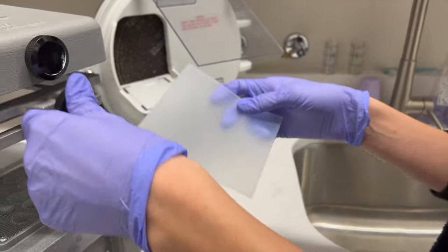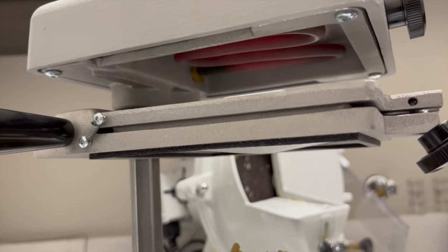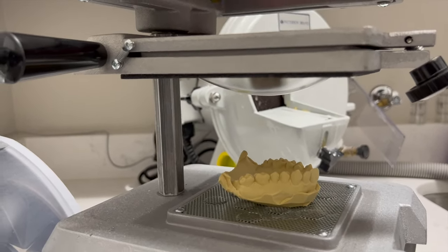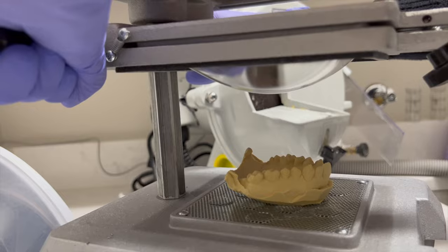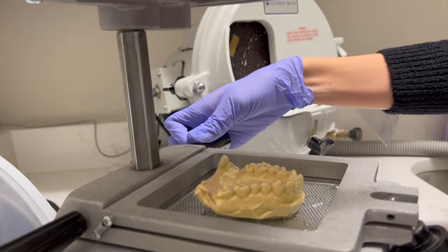The tray material is put into the machine. Once the machine warms up, the plastic material creates a bubble and it's pulled down onto the model of your teeth, forming into a whitening tray around your teeth model. So it will fit custom to your mouth.